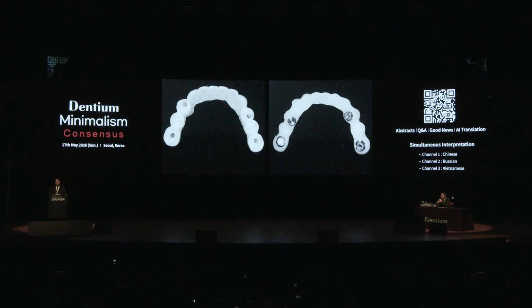Patients often feel uncomfortable with a lower complete denture, so we want to restore the chewing function as soon as possible with fixed prosthetics. In particular, considering the good primary stability of the implants and the complete denture in the opposing arch, we thought the cross-arch one-piece prosthetic, the provisional restoration, would be appropriate for early loading. This is the fabricated custom abutment and the provisional restoration.